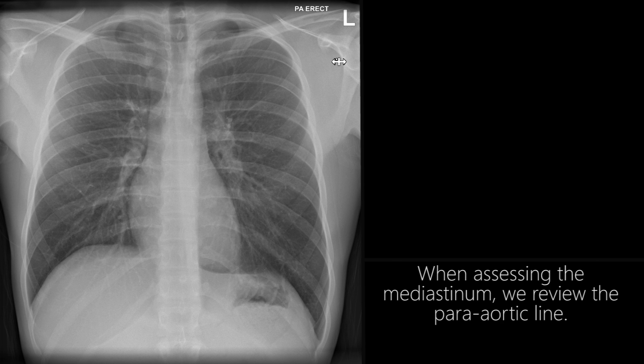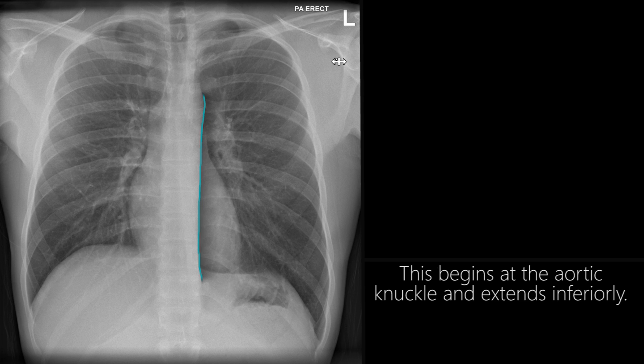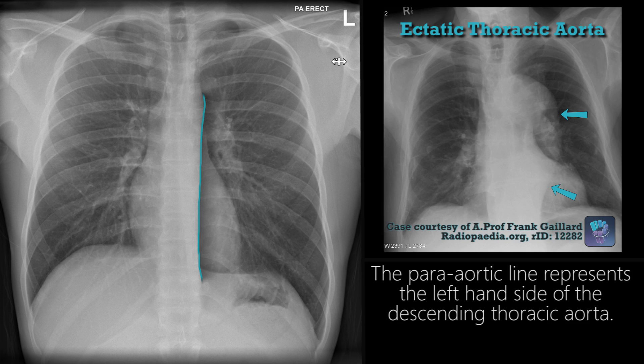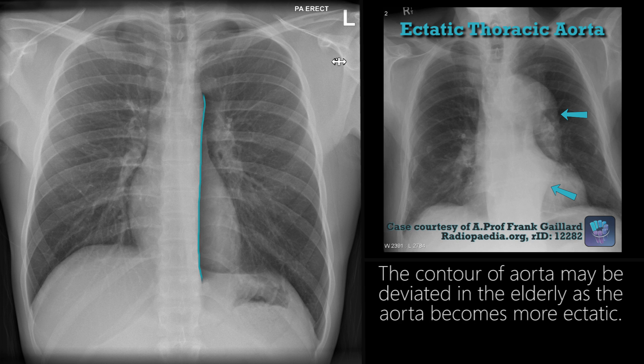When assessing the mediastinum, we review the para-aortic line. This begins at the aortic knuckle and extends inferiorly. The para-aortic line represents the left-hand side of the descending thoracic aorta. The contour of the aorta may be deviated in the elderly as the aorta becomes more ectatic.